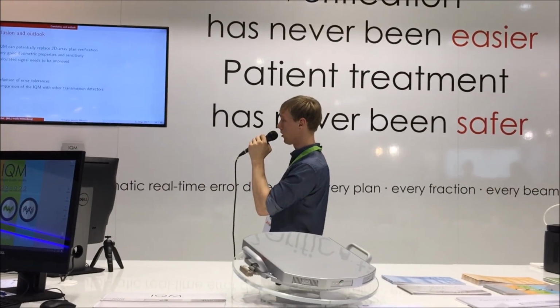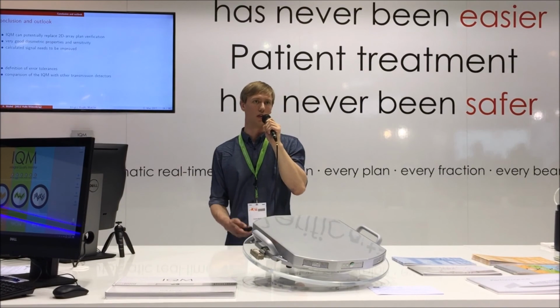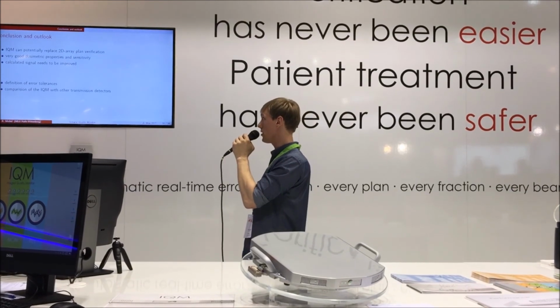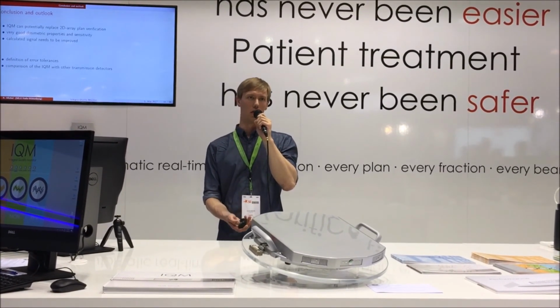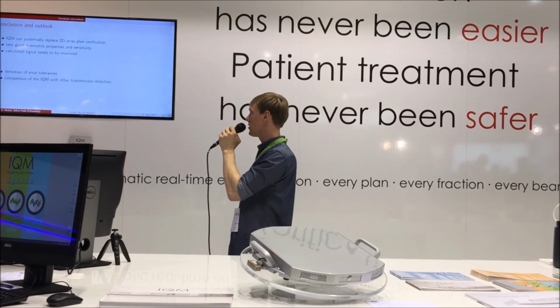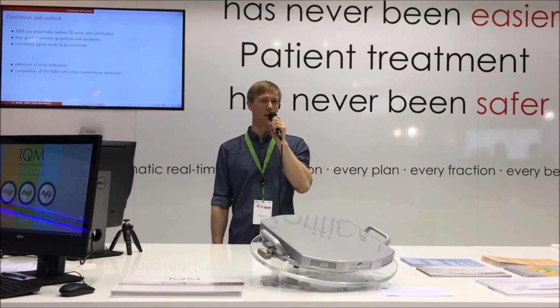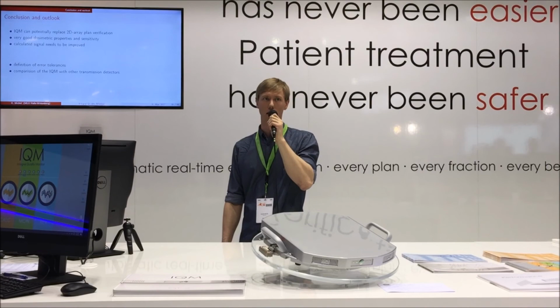And herewith we reach the conclusion of our findings. The IQM absolutely has the potential to replace the 2D array pre-treatment plan verification, and with its online dose verification capability has absolutely the potential to even increase the performance of that method. We see very good dosimetric properties as well as a nice error detection sensitivity. You can think back to the wonderful graph that I showed you that correlated the dose volume histogram deviations with the IQM signal deviations. And to date, my main point of criticism is the baseline shift of only 1% within the calculated signal. But when I have a look at the trend of the performance of the dose engine, I'm pretty optimistic to see another further improvement on that account, and be able to use the IQM in the future.